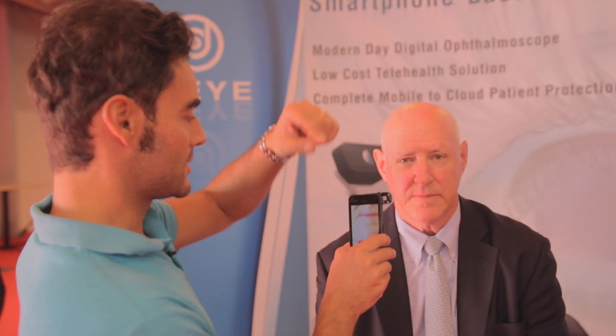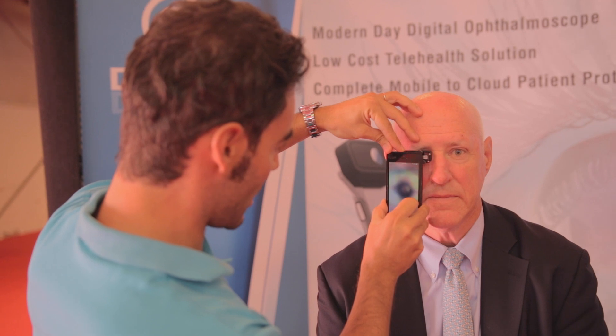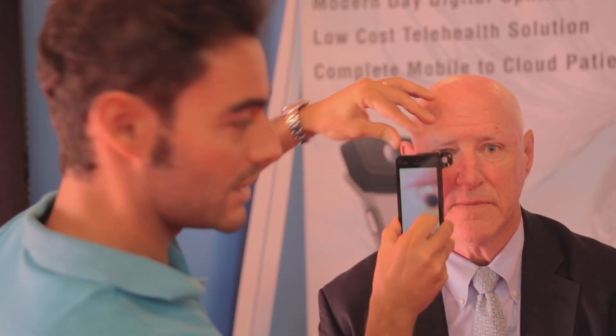This is the demonstration for the undilated eye and it's really fast. Look straight ahead please. Eye search for the optic nerve and wow — we just have the optic nerve in a few seconds.